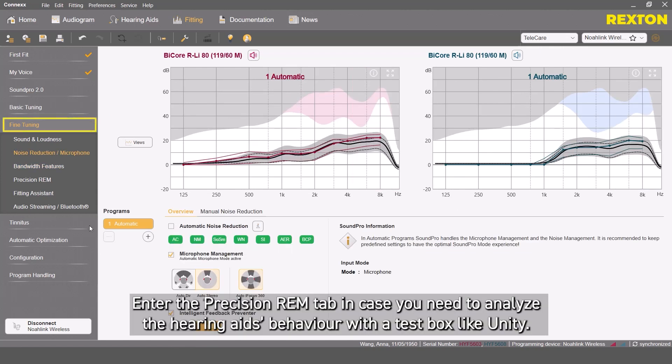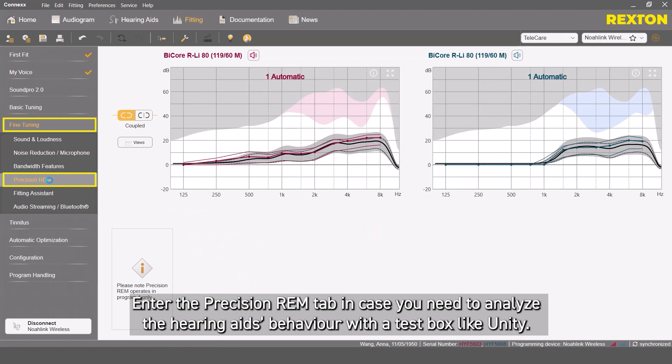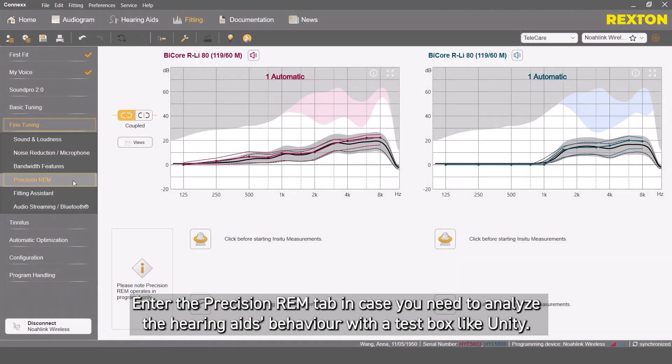Enter the Precision REM tab in case you need to analyze the hearing aids' behavior with a test box like Unity.